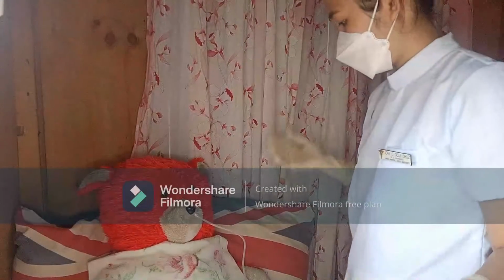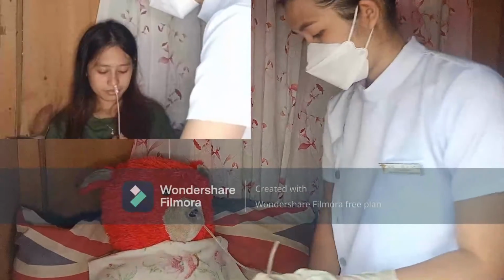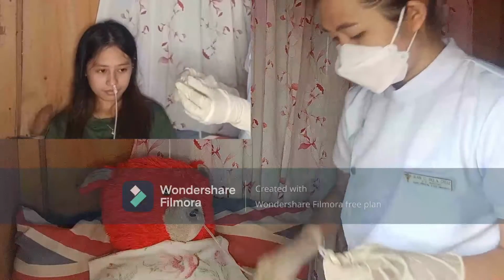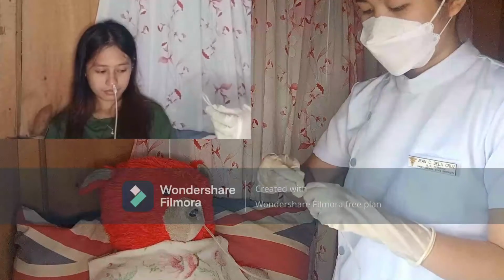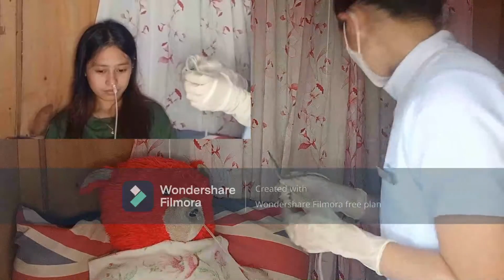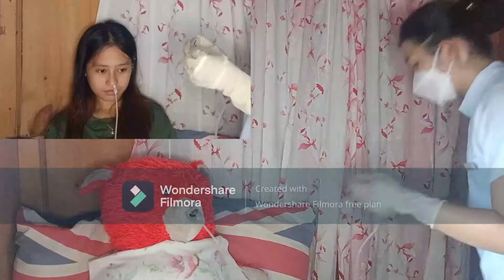Once correct position has been determined, attach the tube to the suction source or feeding apparatus as ordered or clamp the end of the tubing. Secure the tube to the client's gown. Loop an elastic band around the end of the tubing and attach the elastic band to the gown with a safety pin.